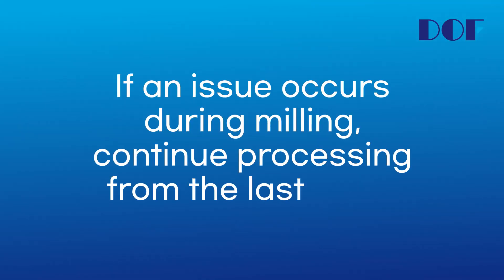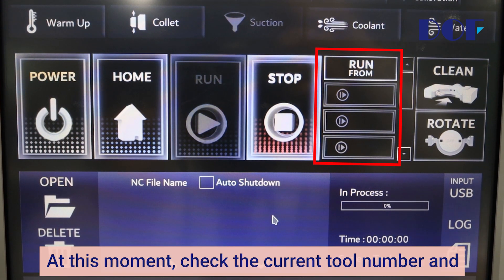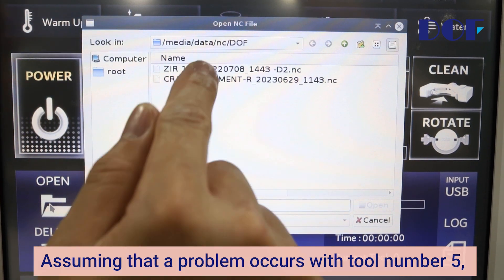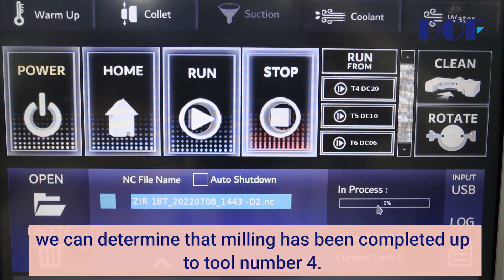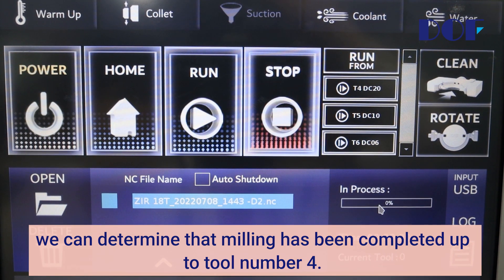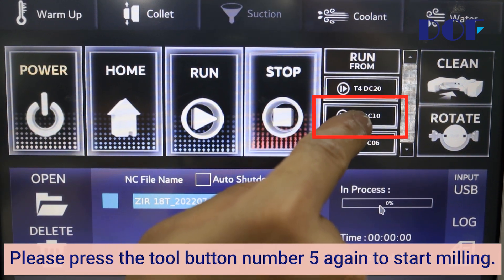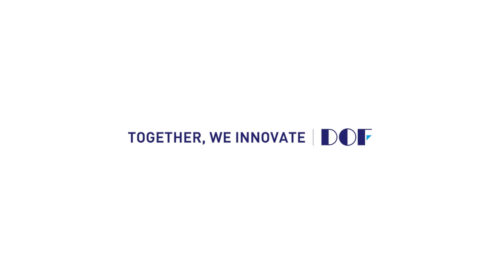If an issue occurs during milling and you want to start milling from the last point, please use the Run From button on the home screen. At this moment, check the current tool number. Assuming that a problem occurs with tool number 5, we can determine that milling has been completed up to tool number 4. Please press tool button number 5 again to start milling.